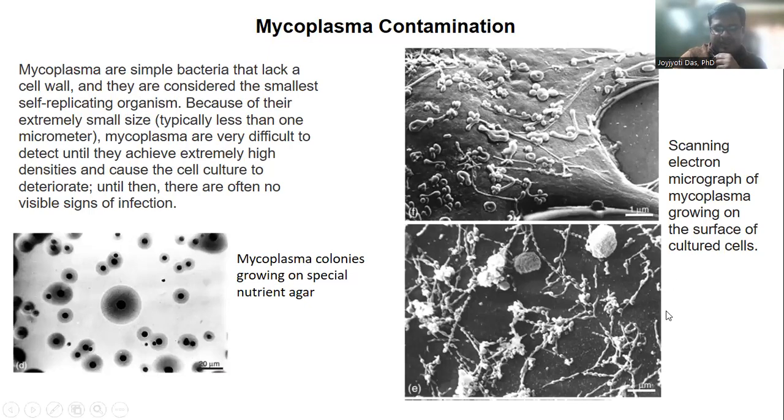From my own cell culture experience, I have seen this, and I stand by this statement: you cannot understand any mycoplasma contamination until, say, the previous night, and then you come back to the lab the next morning and find no animal cells at all. Instead, small black dots appear throughout the bulk of the liquid.